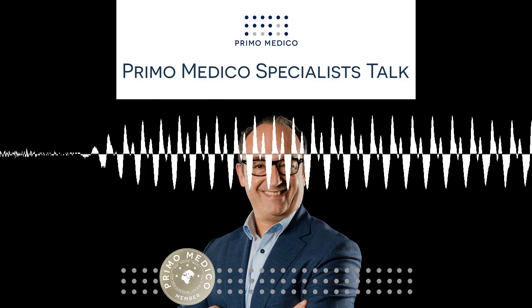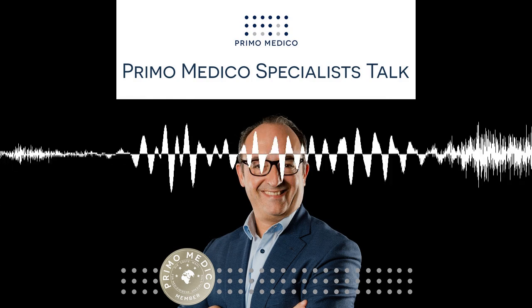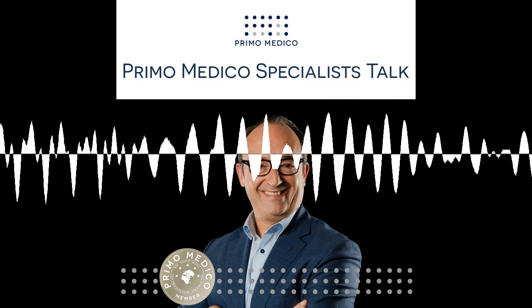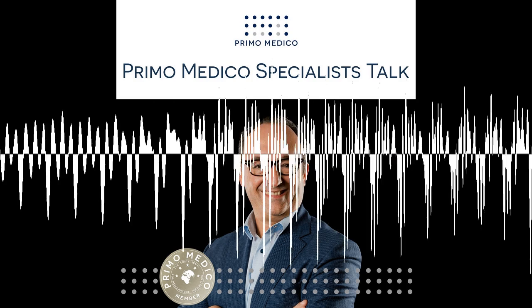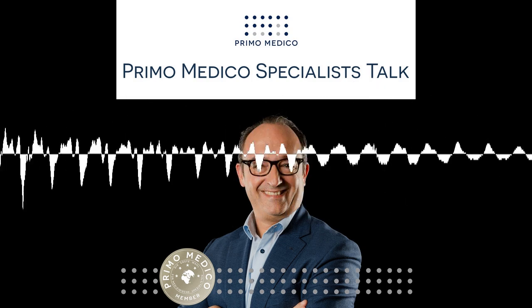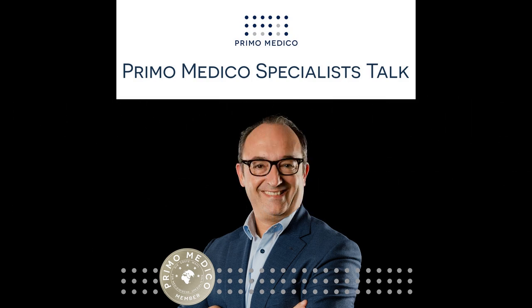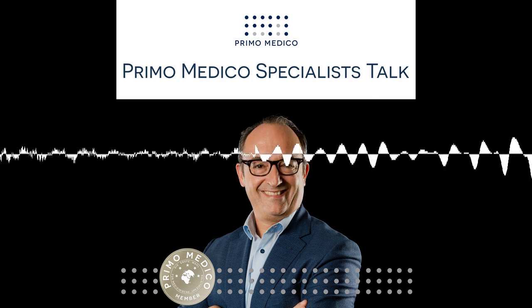Is the surgery stressful and painful for the patients? Well, the patients already suffer quite a lot from the osteoarthritis. On a scale from 0 to 10, they come in at an average of 8. So they come limping and are suffering very much from pain. After the implantation, they tell you right away in the first days, wow, doctor, my arthritic pain is gone. And they think that what they feel at that moment post-operatively is surgical pain. So it is very important to have good post-op pain management and also good management of the soft tissues. And this is quite acceptable for the patients, and they go home with paracetamol or other normal painkillers.